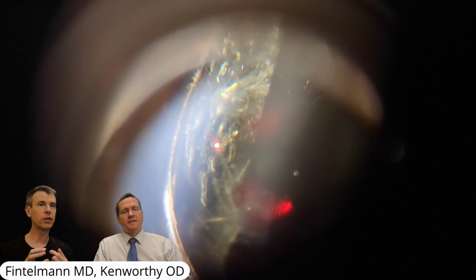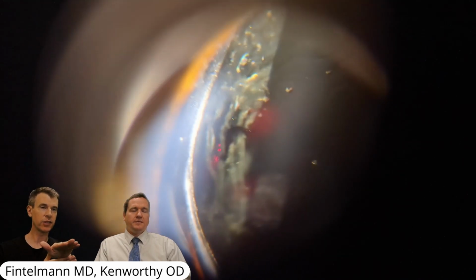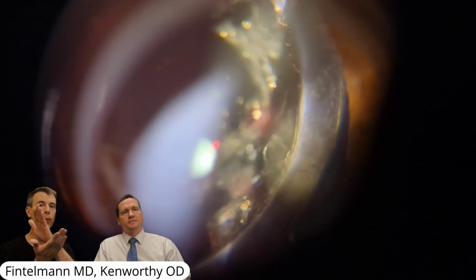There's also, in kids, for example, they always get a vitrectomy, because if they just do a posterior capsulorhexis and capsulotomy, the cells can grow over the anterior hyaloid and use that as a scaffold. And I've had that now in some of my cases. I've started doing a posterior capsulorhexis, but I had another 2 patients where the anterior hyaloid, even in an adult, opacified and I had to do a YAG to remove this. Any patient where we do a YAG, usually both the posterior capsule and the anterior hyaloid is treated.